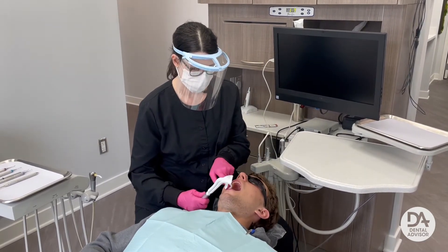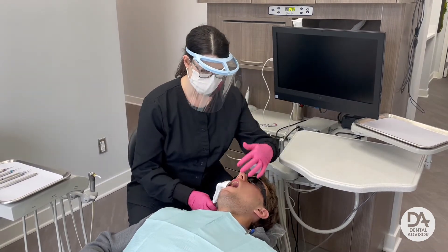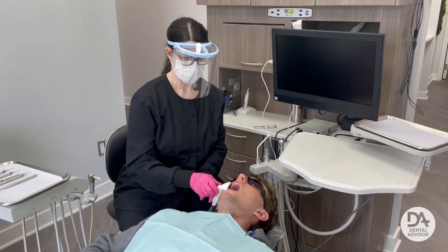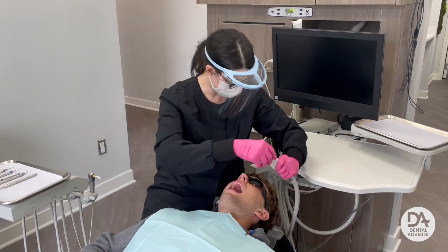When working on the left side of the mouth, place it on the right side. When working on the right side, place it on the left side.